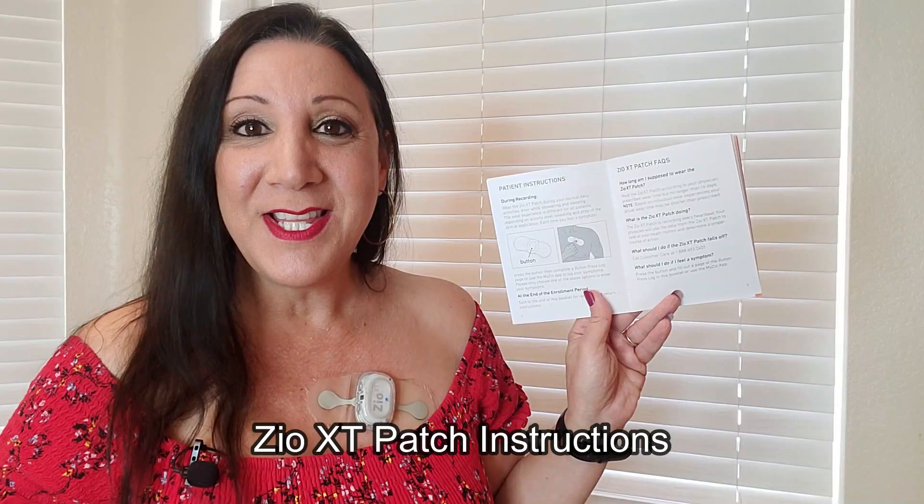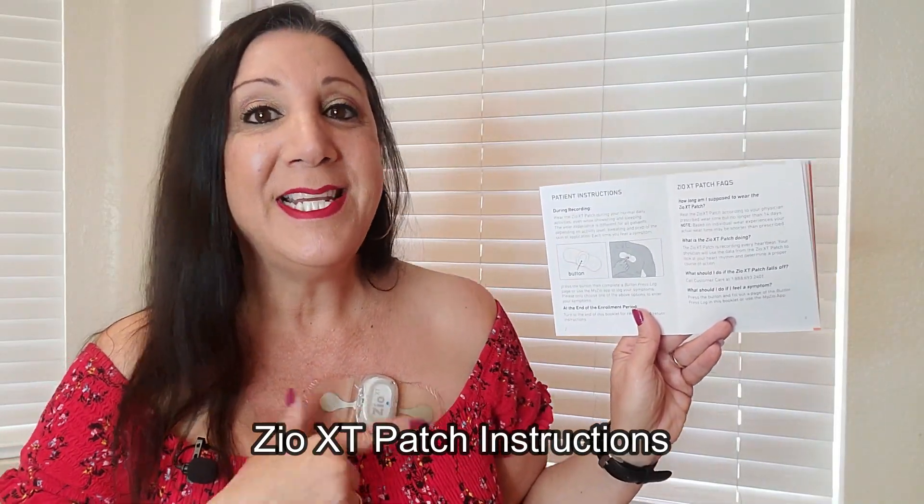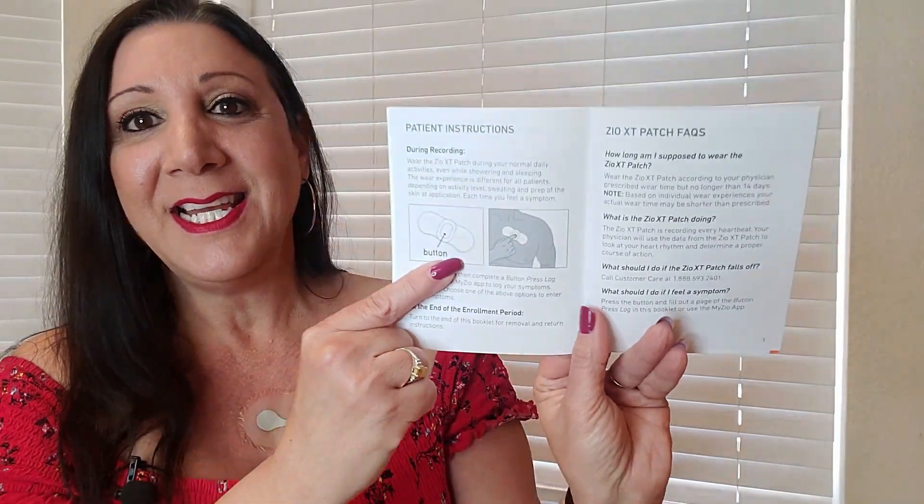Now let's go over the instructions. While you're wearing it, you're going to push this button any time you feel your heart pounding, racing, fluttering, or skipping beats. My issue is I have irregular heart rhythms, so each time I felt that I pushed it. Even if you're sleeping and experiencing this, don't worry — it still logs it 24/7, and all you have to do is push the button.